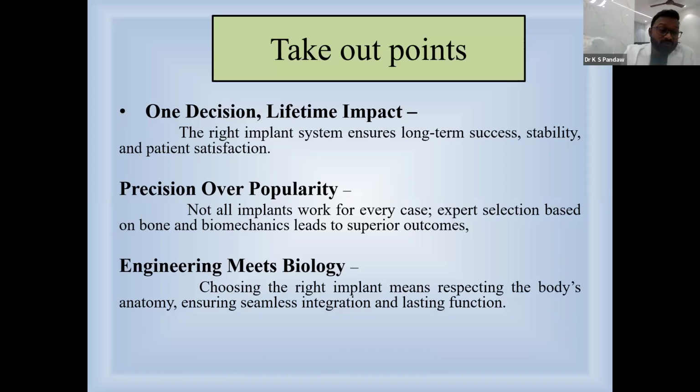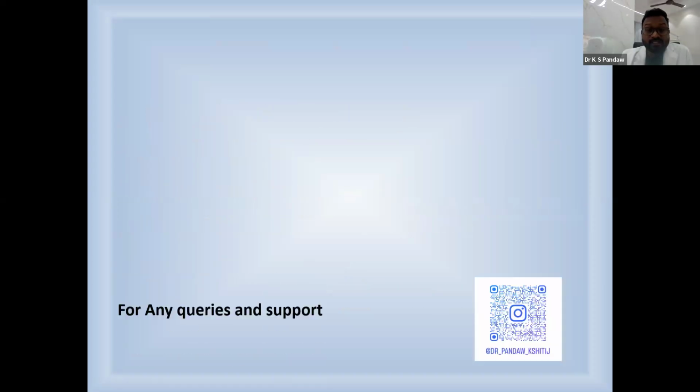So in this webinar, we saw the evolution of implants and the different types of implants. We talked about conventional implants, bicortical implants, and immediate functional loading. For immediate functional loading, we use this hybrid TBR system, which works on the principle of the tilted implant concept.